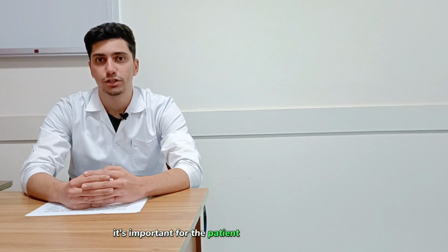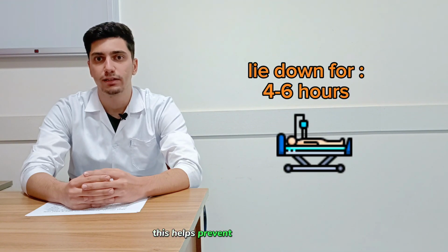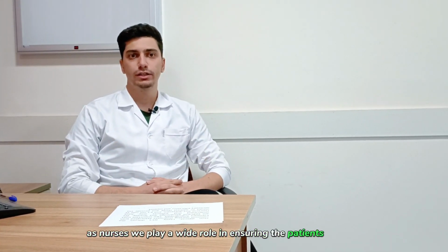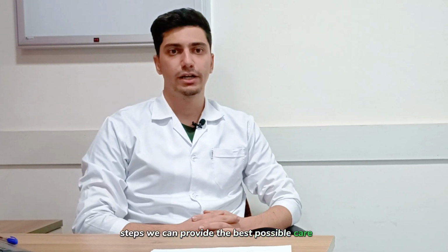Finally, after the procedure, it's important for the patient to lie flat for 4 to 6 hours. This helps prevent complications and allows the puncture site to heal properly. As nurses, we play a vital role in ensuring the patient's comfort, safety, and well-being throughout the entire process. By following these nursing care steps, we can provide the best possible care for our patients undergoing a coronary angiogram.